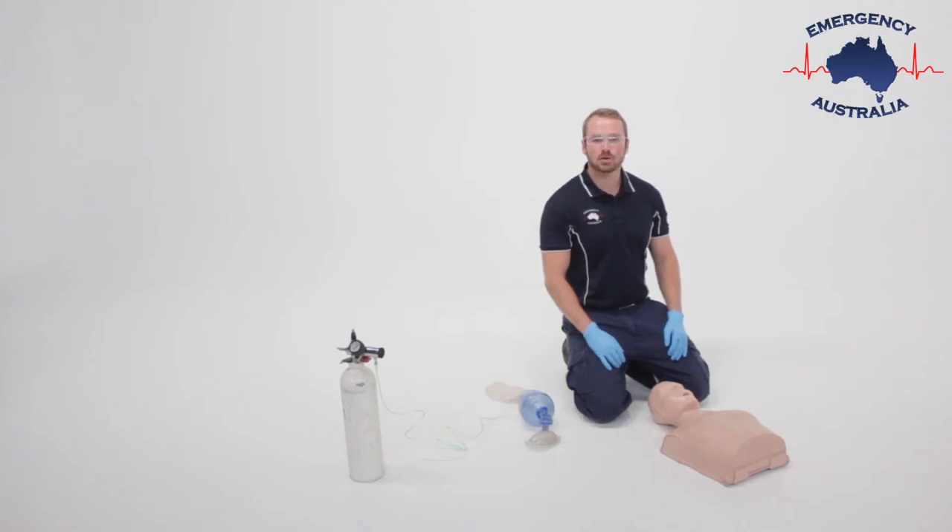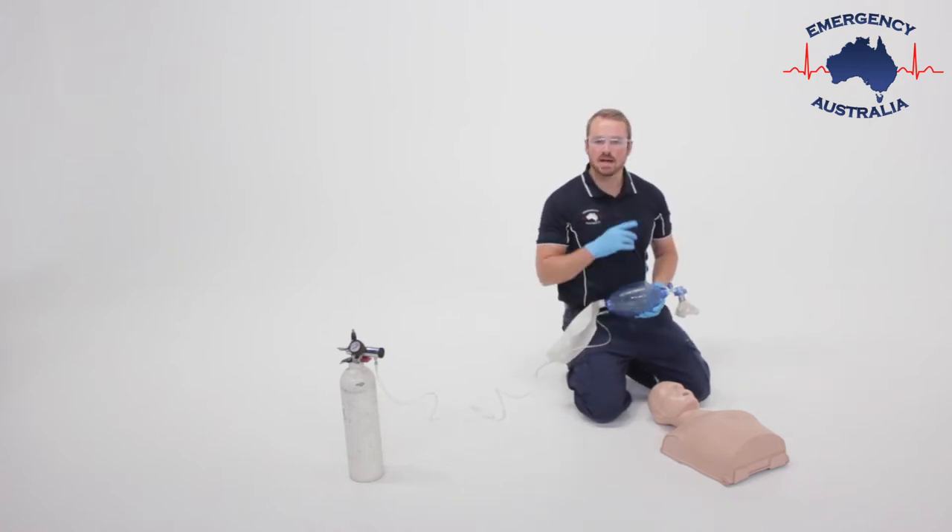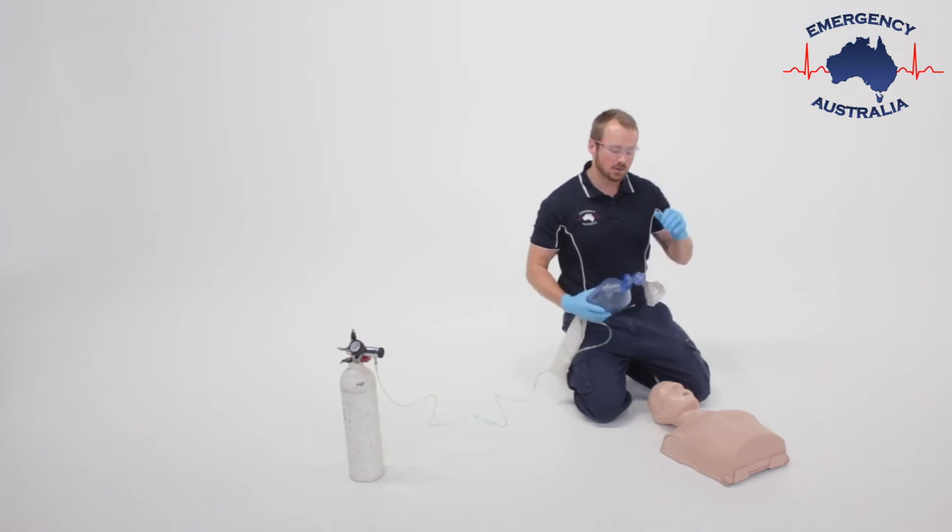During this video we'll show you how to correctly use a bag valve mask. Using this bag valve mask to maintain a good seal, we use the C and the E grip.